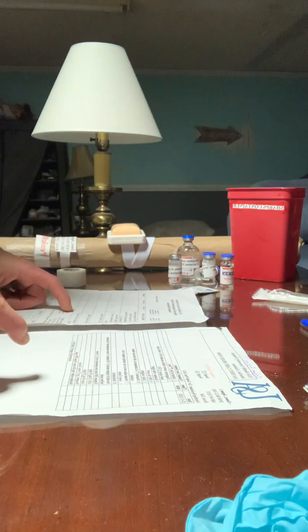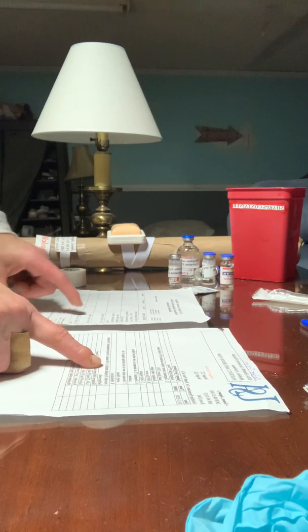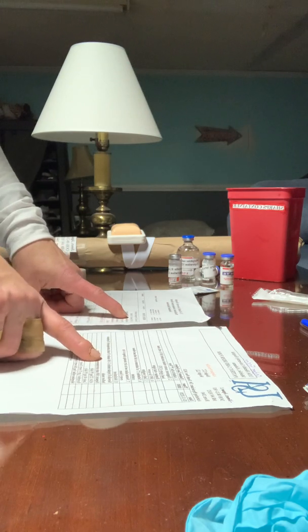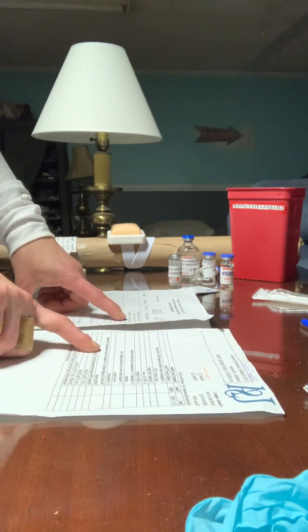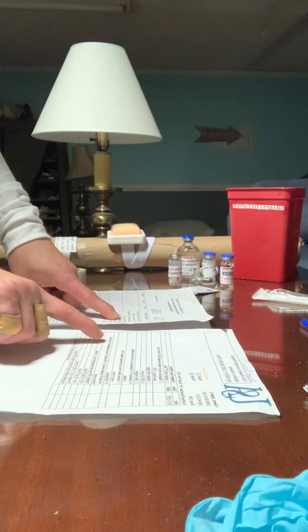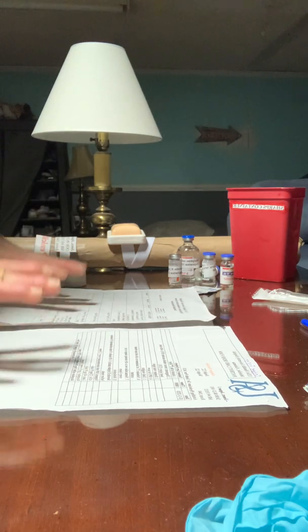We have an order for Mr. Jones to receive Novolin R regular insulin, U100 insulin 10 units, subcutaneously 30 minutes before meals. It is coming up on 30 minutes before meals, and he has not had this medication within the past several hours, so it is safe for me to proceed to prepare this medication for him.